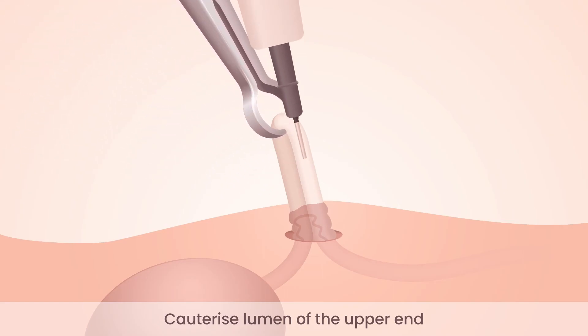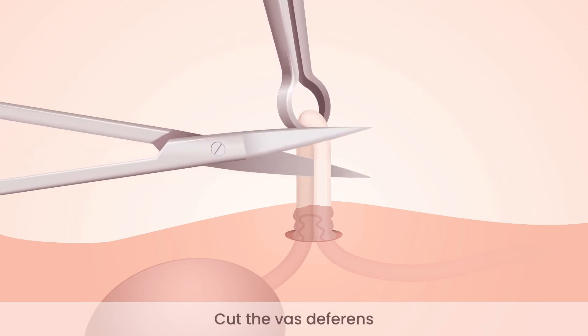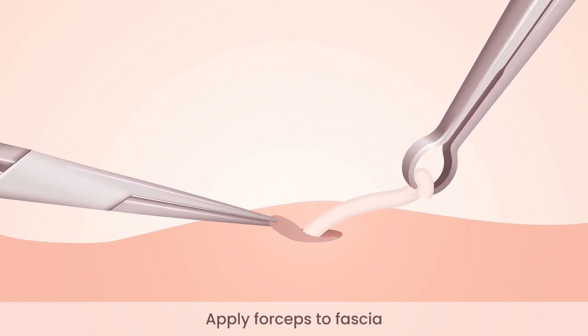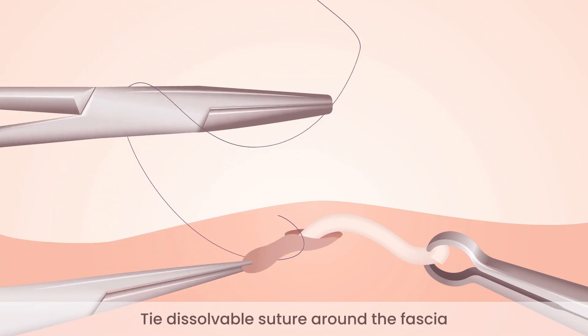Here we are cauterizing the lumen or inside of the tube — it's just turning white as the needle electrode is withdrawn — cutting the tube just above the site of the cautery. The testicular end has been held up here and the abdominal end has slipped down inside, just underneath the fascia.